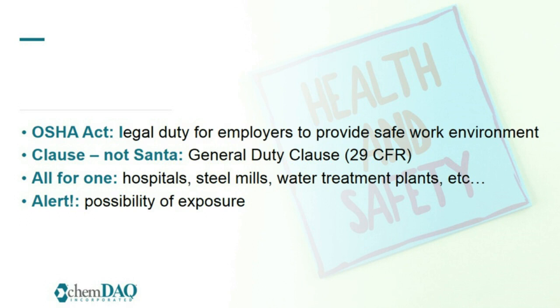And before I jump into this, when we talk about safety standards, leaders, how many times have you gone into your decontamination area and your staff have not been wearing the appropriate PPE? That would fall under this act. It would also fall under the OSHA bloodborne pathogen rule that we know is in 29 CFR 1910.